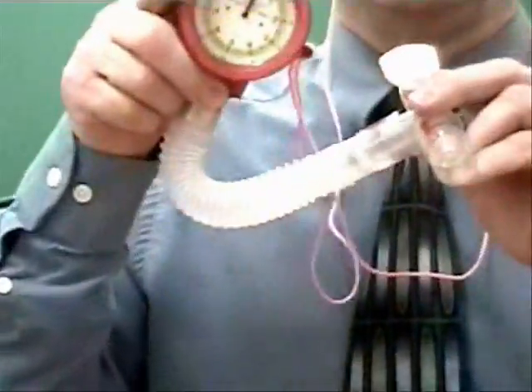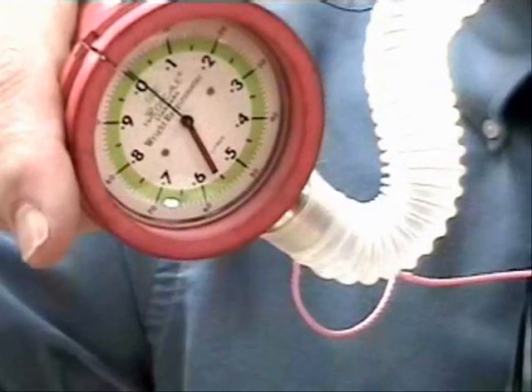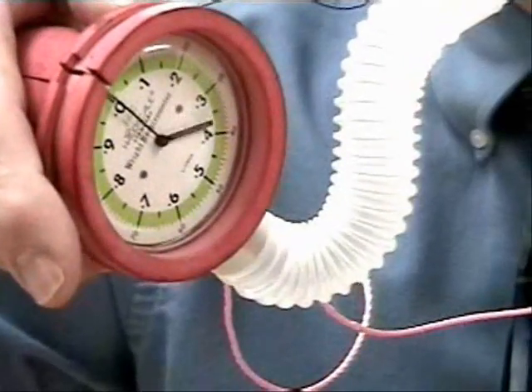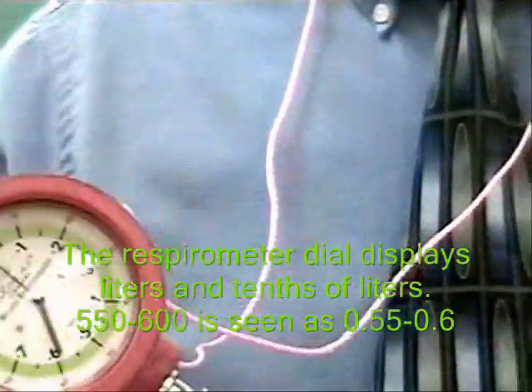And as the patient breathes, let's reset that. You will see the volume of each breath was between 550 and 600. That is a tidal volume.